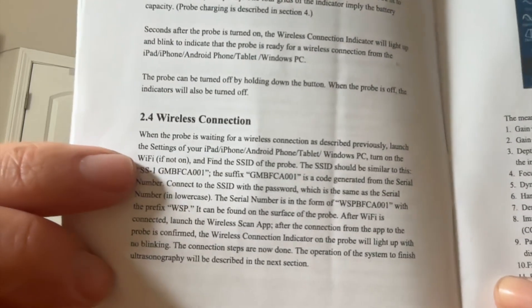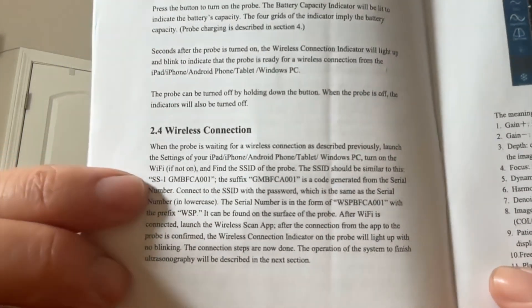The next most important thing is the wireless connection. Once this device is on and the little wireless indicator is blinking, you go into the settings of your phone and find a network similar to the letters in the guidebook — something like SS1, some letters and some numbers — and connect to that network. Then you enter the serial number as the password for the wireless network. I did this on my phone and it automatically connected to my iPad. This took me a little while to figure out, but once I read it word for word, I got it figured out.